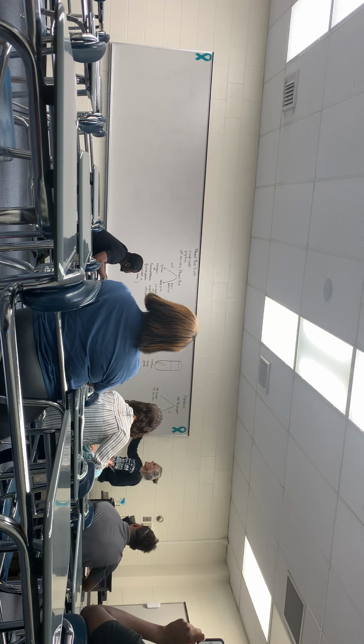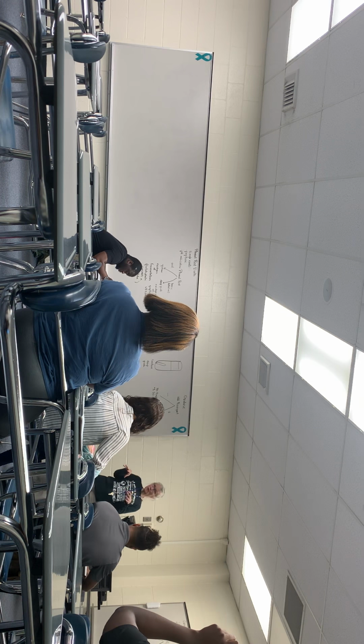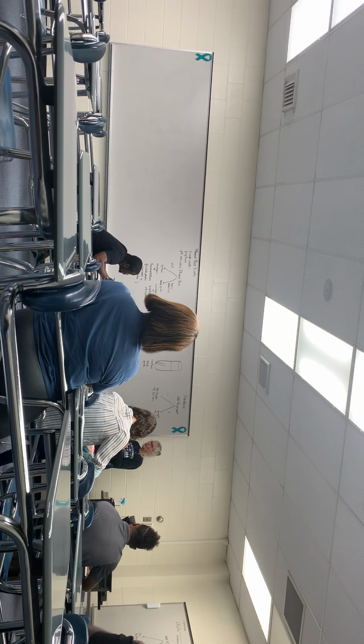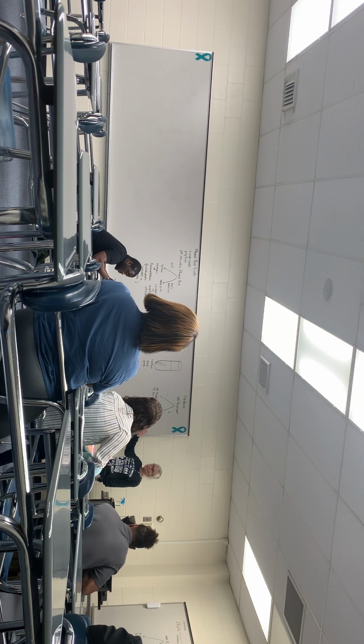Okay. The oxidase test, that's the one that you add the reagent to and you get the purple color. The key to that one is you have to get the purple color within 20 seconds. Okay. Everything will turn purple eventually. You got to see it within 20 seconds to count that as a positive. So if you get that purple color within 20 seconds, you know that oxidase was present.